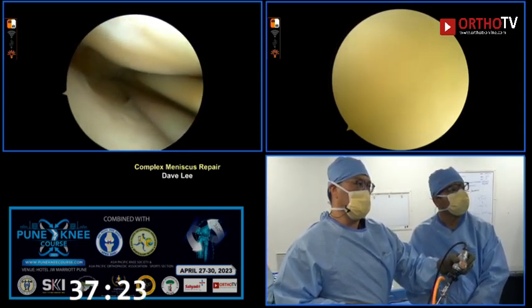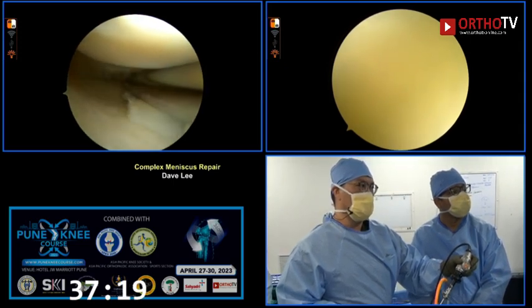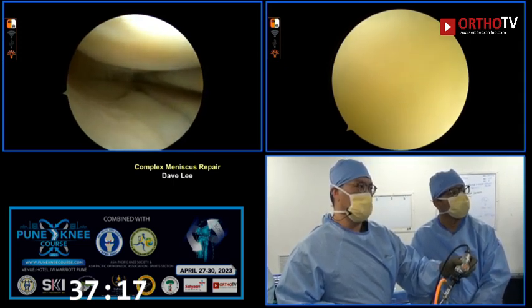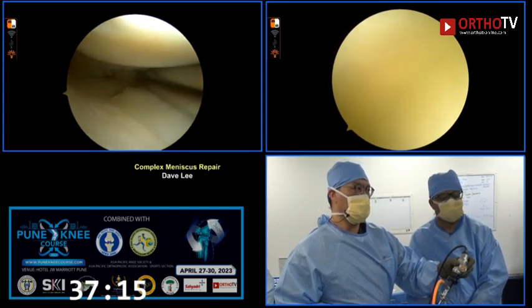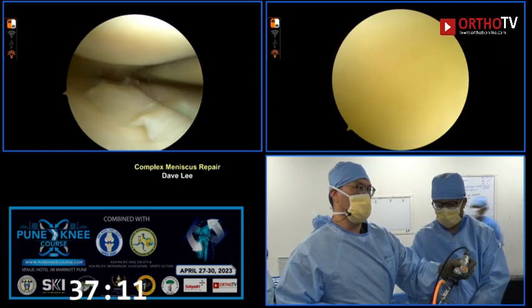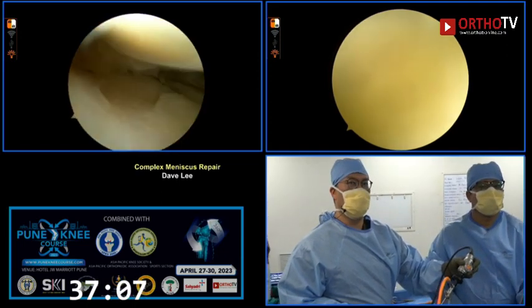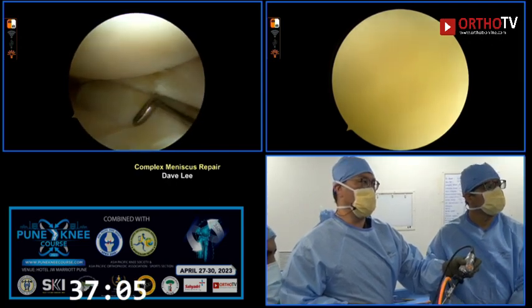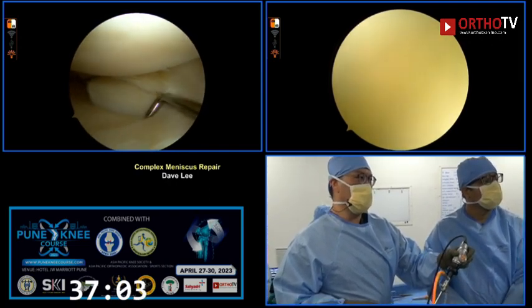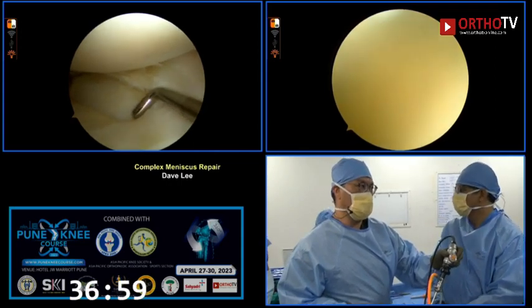Preparing the bed posteriorly, you can see just adjacent there's the root, and so clearing it, rasping. Okay, can we forward a bit, please? Okay, and this was what I had after. So the question was whether I should fix or excise it.